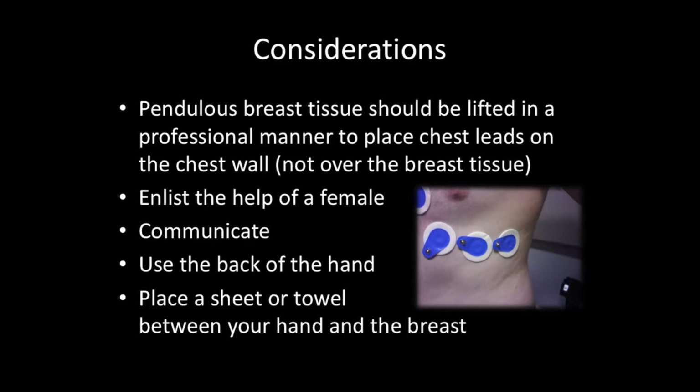There are different ways you can address that. You can ask the person herself to lift it, right? Then you're not touching their breast. You can ask a female partner if you have one, or if there's a female relative they're okay with. Generally, enlist the help of a female. Communication is, I think, important: tell them what's going on, what you're doing, and stuff like that. Generally speaking, it's not a big deal. It seems like a big deal, and everybody's like, ooh, but it's not that big. I have not experienced it to be a big deal.